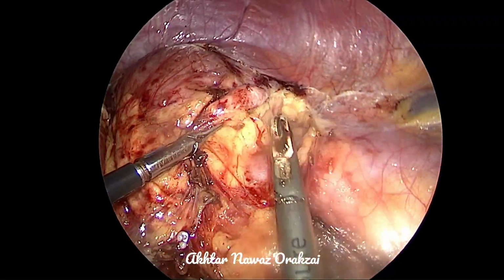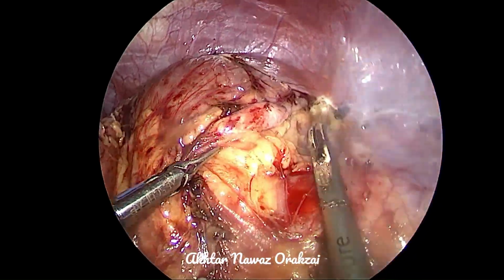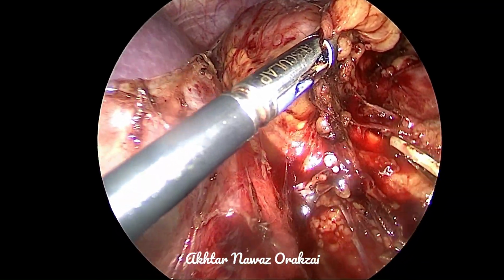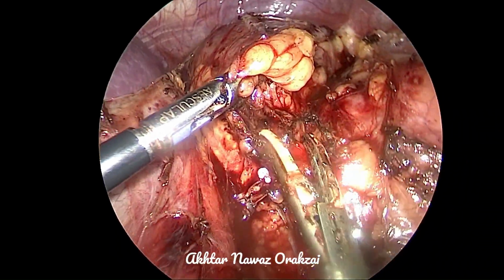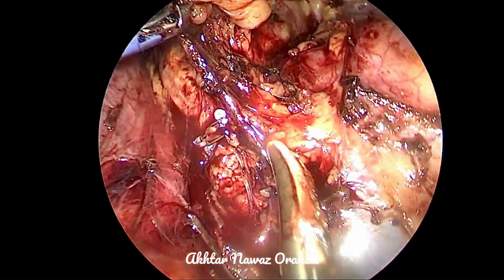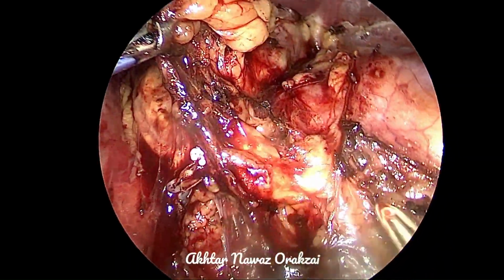Or a more important thing, which we'll discuss in this video, is that we must take care of renal arteries, because if we are going so close to the parenchyma of the upper pole, there are chances that there may be a small branch of the renal artery, and that may be compromised.